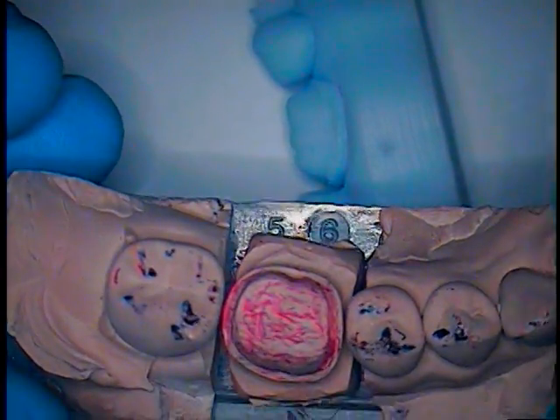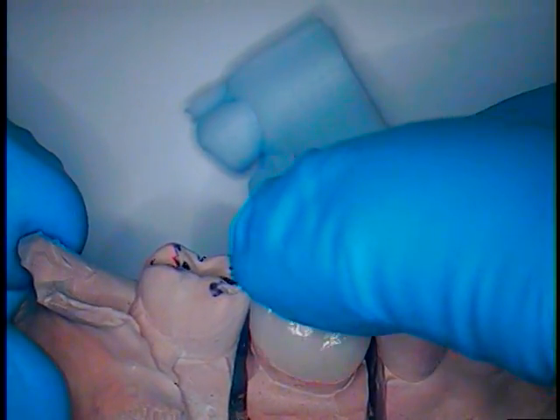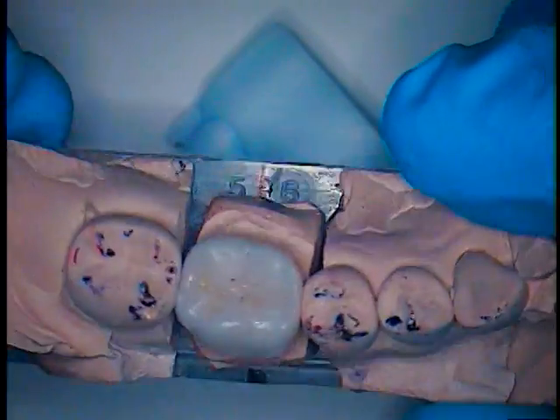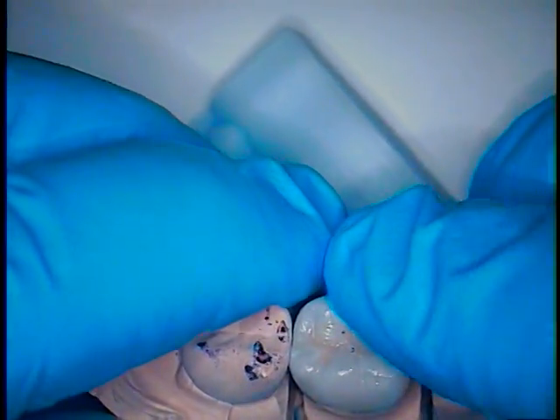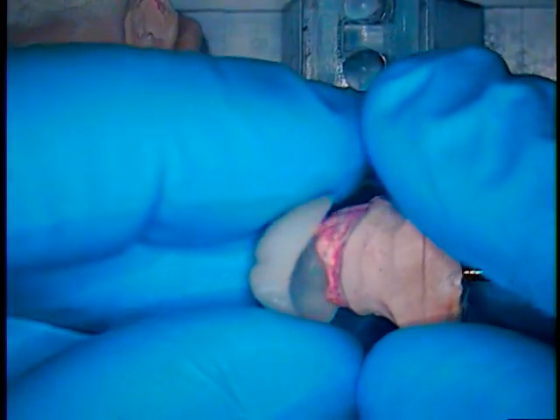Let's try the permanent crown on the model that was made in class. So we'll slide that into place. We notice it's a little tight going in. It might even be abrading the adjacent tooth as it does that, but finally it did snap into place. We also notice that the margins are very, very good. We discovered that there were some areas during the scanning technique that we weren't quite comfortable and confident under the contact, but the representative for the company was able to help us scan and capture a pretty decent rendition of our preps.